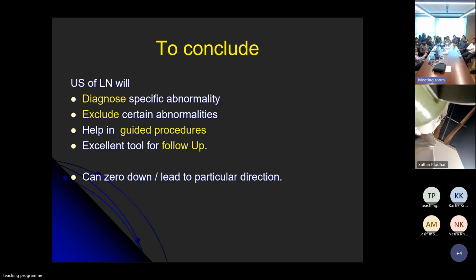Suppose we gave 2 nodes positive on nodal ultrasound, and you also got 2 nodes, then we find that very encouraging. Though an important thing is, when we say 28 nodes dissected, I don't think we necessarily see them all. That is one of the important points. As a radiologist, I would remember that I may not be able to see all the nodes.